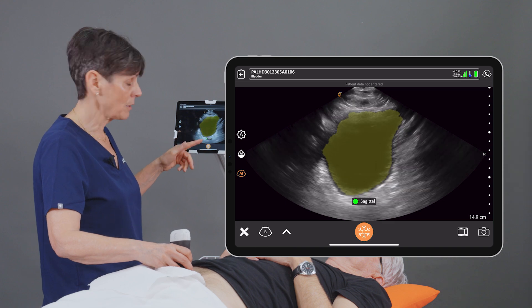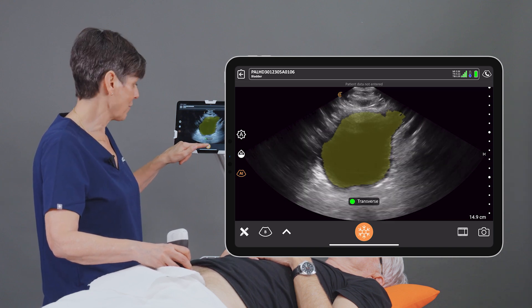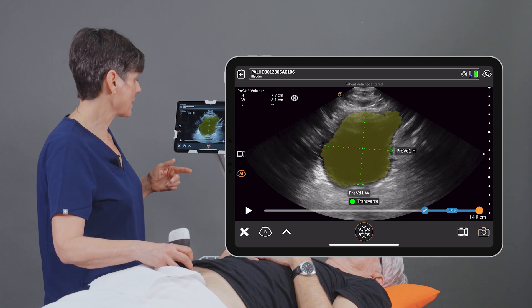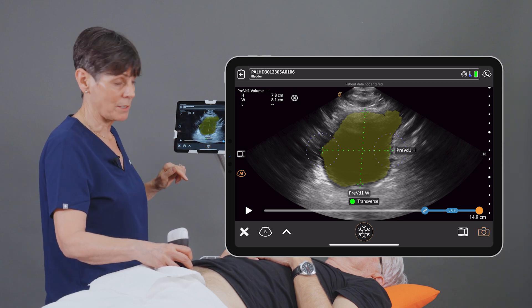I'm going to scan through the bladder a little bit, get the nicest biggest picture I can of the bladder, and then I'm going to hit the Freeze button. You'll see that calipers are automatically placed. In this case they're totally accurate, but you can adjust those calipers if you want.